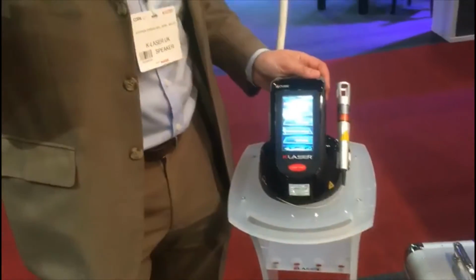So that could therefore have an effect within the spine? Well within the spine, because with the spine you're only talking about 4 or 6 centimeters, whilst obviously when I'm treating an equine patient, I could be up to 25 centimeters. So the ability to do that is there on this. Can you show us very quickly a few of the other aspects of this?